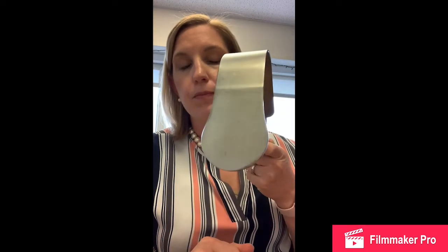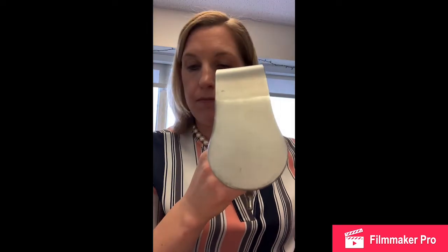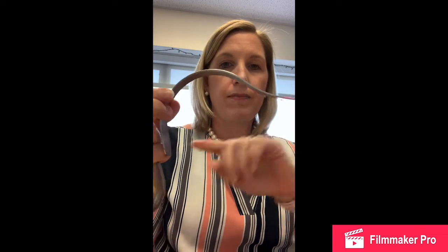Now, the next one, I admittedly only know our local institution name for it. We call this a FOSS retractor. This is also helpful for holding up the abdominal wall. Many of you might have thought this was a Deaver, which I would have thought as well, but you may contrast this to this letter J, which I asked you to say. J is actually a very narrow Deaver. See how this Deaver curls up, goes down, and then angles a little bit up again. A little bit of an ergonomic hold when you're trying to hold something up.